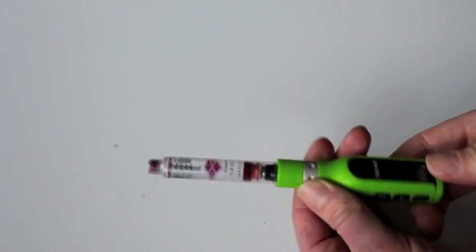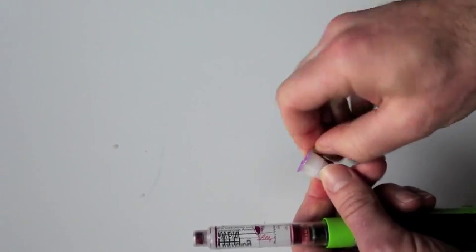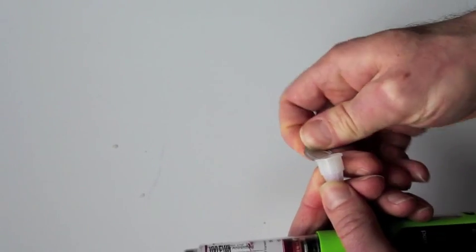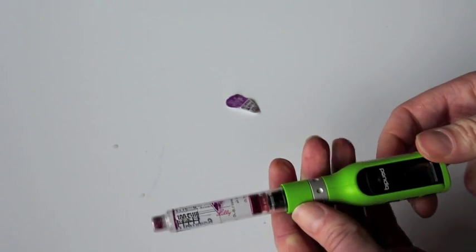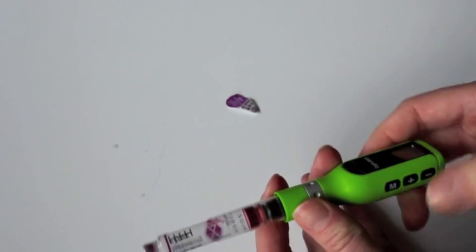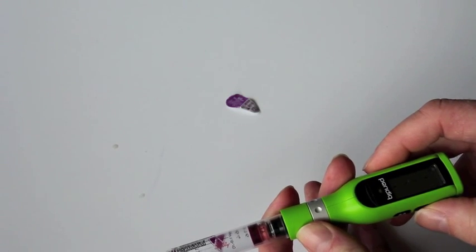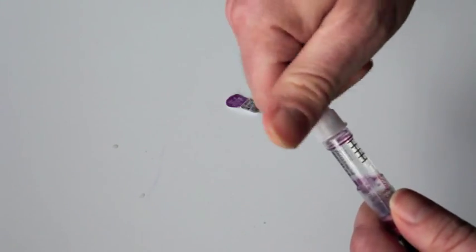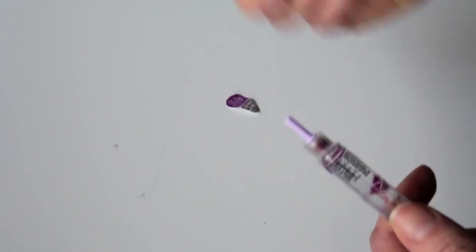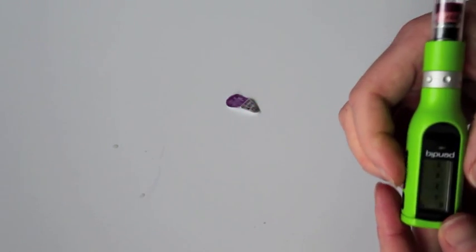Press M four times — one, two, three, four. Now we press plus. Now I think we're supposed to put the needle on here. Put the needle on, and then we've got to get rid of the air in there. So let's press plus.